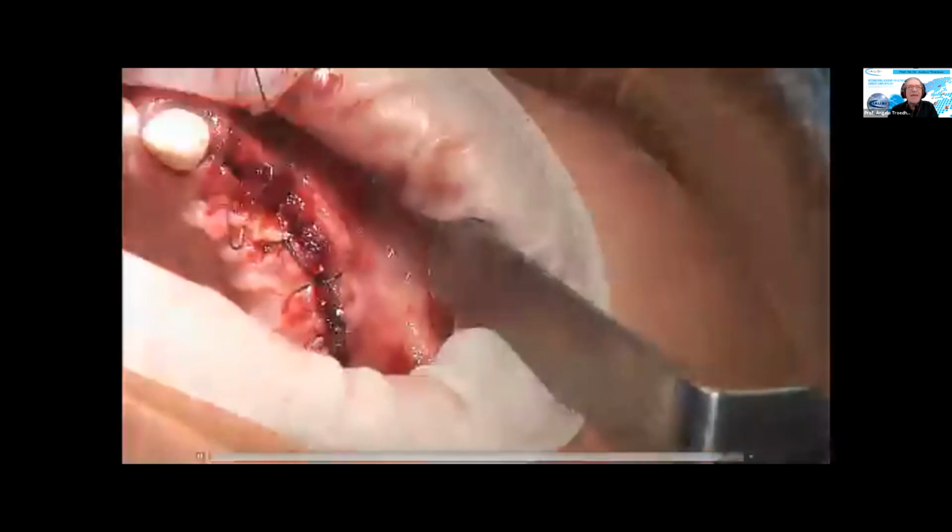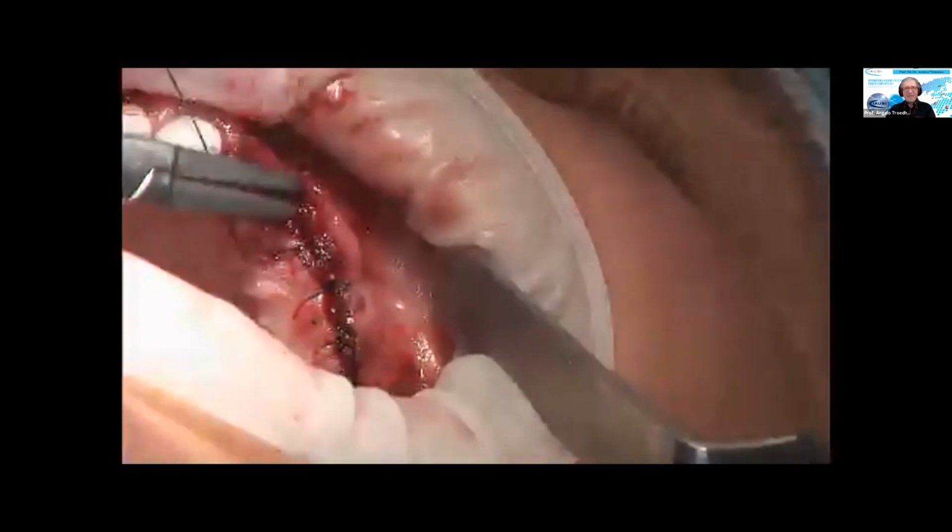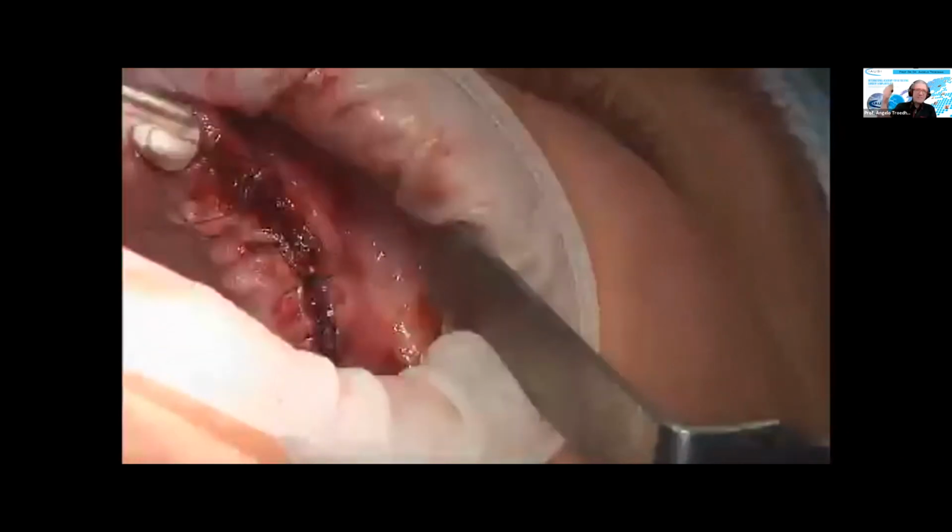And in some areas, you might see, okay, there is a small dehiscency. Of course, it's not a problem. It's the same dehiscency you have when you just simply extract the tooth. Always imagine what happens.